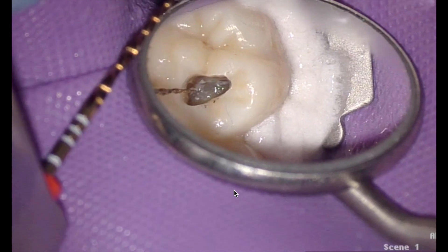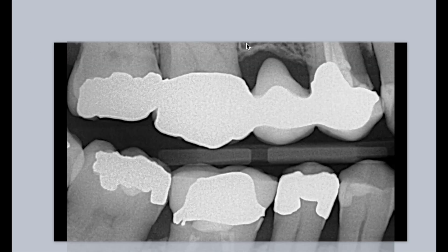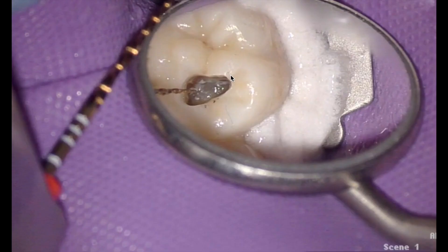What we found here — I've cut out a bunch of video — but this is that groove right here. It actually came into play when we look at our bite wings. You can see that groove right there. That might actually be the palatal canal, but it's hard to say. What that is, is right here — and it actually opened up nice.